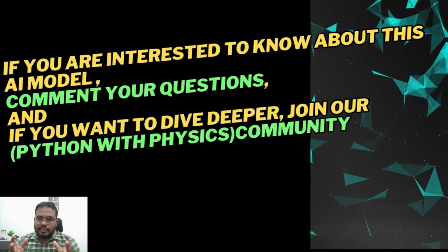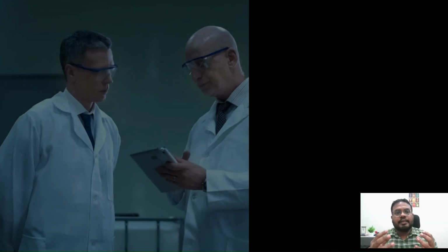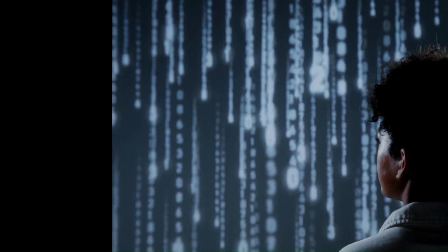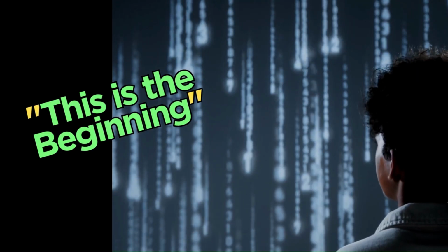So yes, Python isn't curing cancer alone, but it's absolutely helping medical physicists do it faster, smarter, and earlier. If it fascinates you that something as abstract as mathematics or code can actually help save lives, know that this is only the beginning. So let's do it with Python.